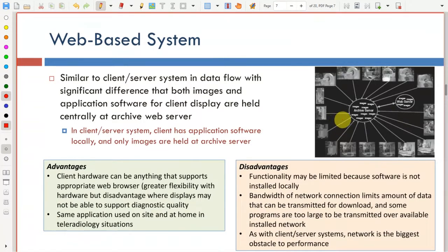When you have, for example, in the US, Cleveland Clinic, one of the very large hospitals in the US, or Mayo Clinic, they have different branches. You have different locations, and they are all connected together. So when they are connected together, depending on the kind of workload that they might have at a certain time, doctors from another branch might be working on data from the other branch. So this would connect to the other branches.